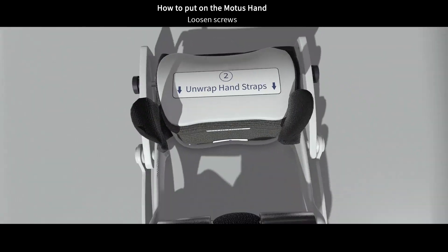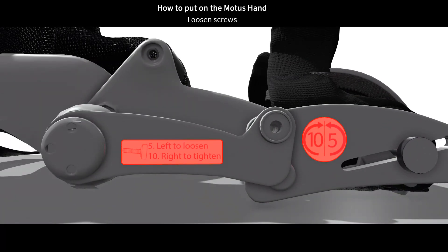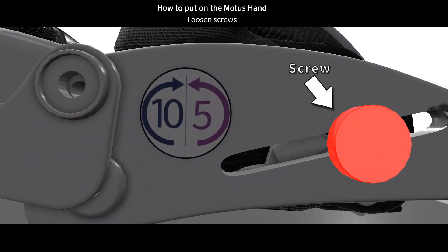Now let's do the same on the other side. Find the step 5 and 10 sticker on the right side of the hand linkages. Now, loosen this screw by turning it 3 turns counterclockwise.